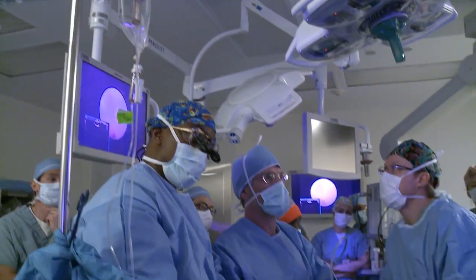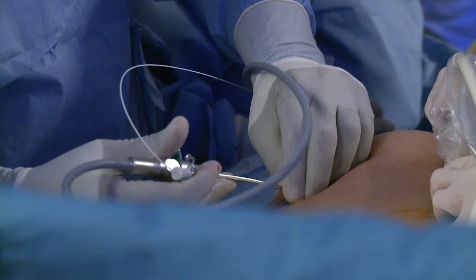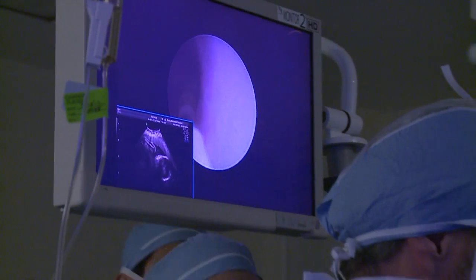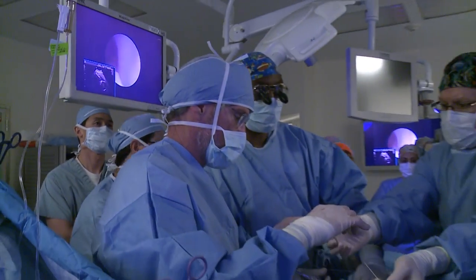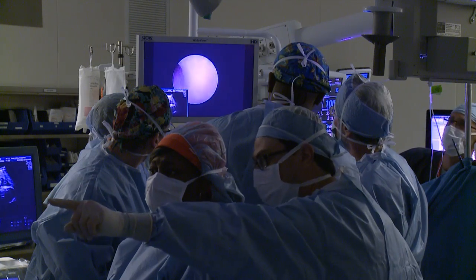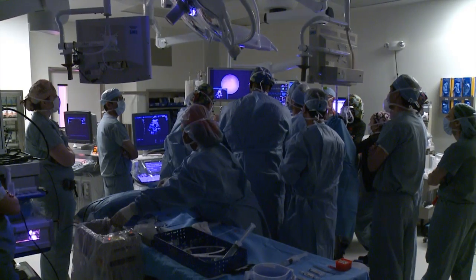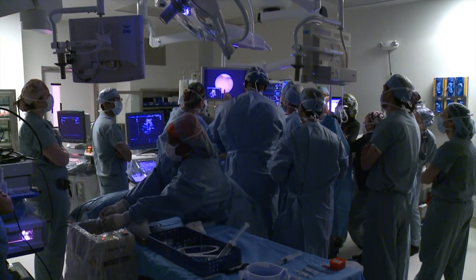The procedure today went quite well. It was a little technically challenging, as these cases tend to be, but that's why you have a team of experts that are very good at what they do, and with all the heads together, we're able to persevere and get it done. The balloon was placed in a perfect position below the vocal cords in the trachea. We're able to confirm the position. The baby did great through the operation. Mom had excellent anesthesia. Baby had excellent anesthesia. Mom and baby are comfortable in the labor and delivery service.